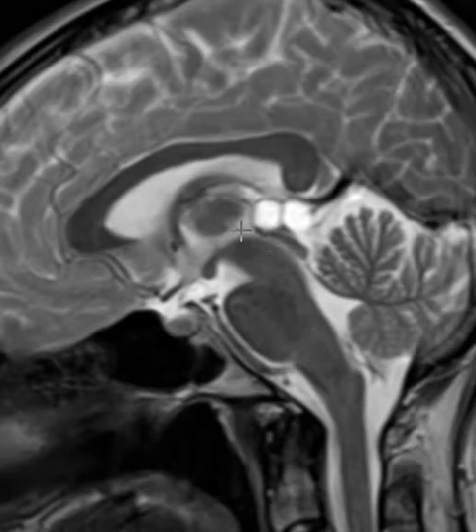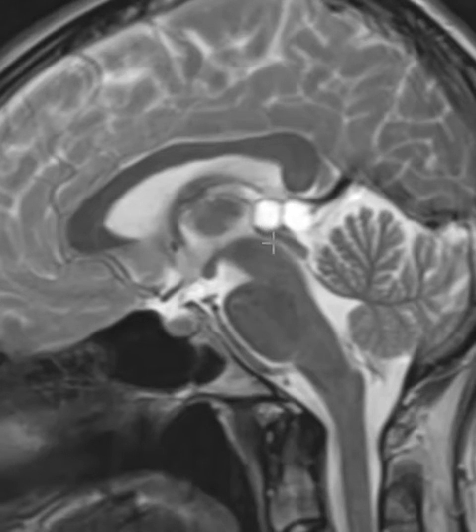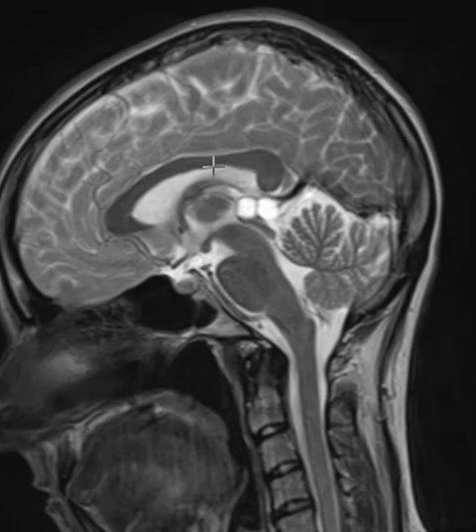And this is a little channel that communicates between the third ventricle, where the fluid flows in the brain. Fluid is flowing all the time. This is the lateral ventricle. It flows out of that into the third ventricle, and it goes through this little channel that's barely discernible into this fourth ventricle, which is a little bit bigger, and then out down here. Again, when these cysts get large, you can see how it would push down on that tectal plate and compress that little tiny channel, and the ventricles can enlarge and cause what we call hydrocephalus. This patient does not have that, thankfully.